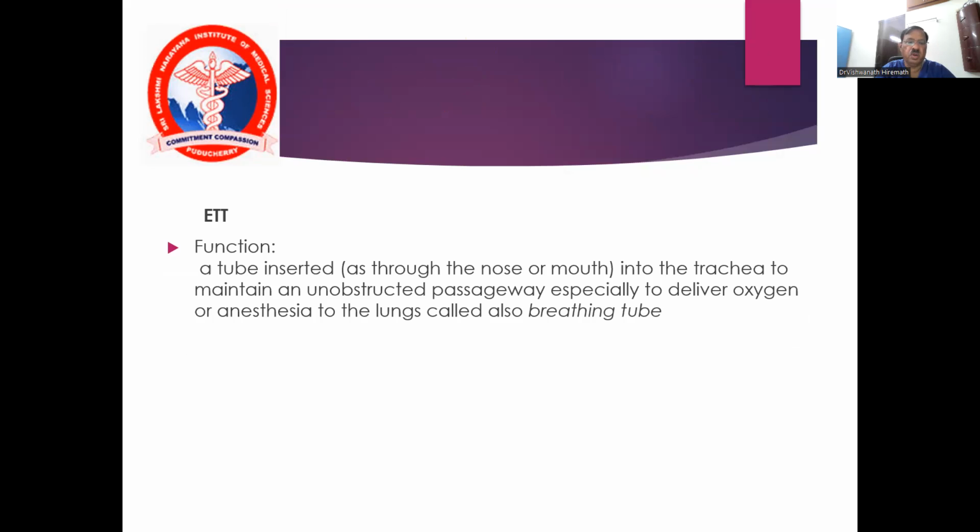Endotracheal intubation helps in providing an unobstructed airway to deliver oxygen in airway difficulty or respiratory failure, or providing oxygen and anesthetic agents for anesthesia during surgery.